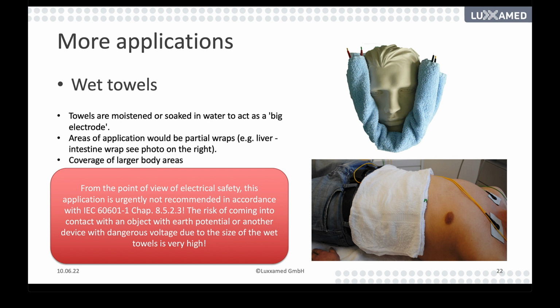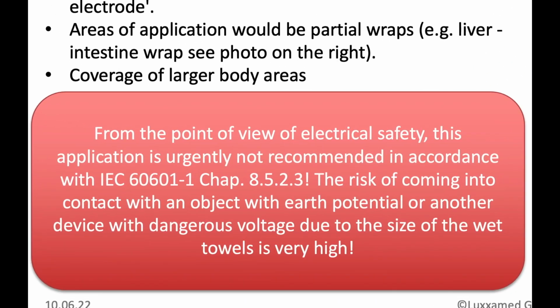But also in our point of view, it is not really recommended, because here is the potential that you get contact with earth parts, or with a dangerous voltage because of the big size of the towel, and it's quite wet. If it's too wet, it's dropping down and something like this. So it is quite unsafe to use it in that way, just for your information.